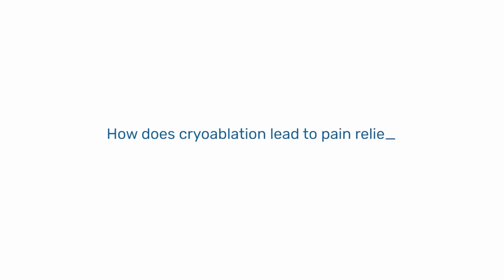With the cryoablation, you're not removing the whole mass, you're just freezing off the bad tissue. And so you are getting pain relief just by freezing off that bad tissue, correct? That is correct. In FAVA, there are several factors that actually contribute to the pain. These include bad muscle tissue or abnormal blood vessels which are sitting within the malformation. And there is a lot of tissue scarring within the FAVA malformation. And sometimes there are bad nerves which are in and around the malformation.